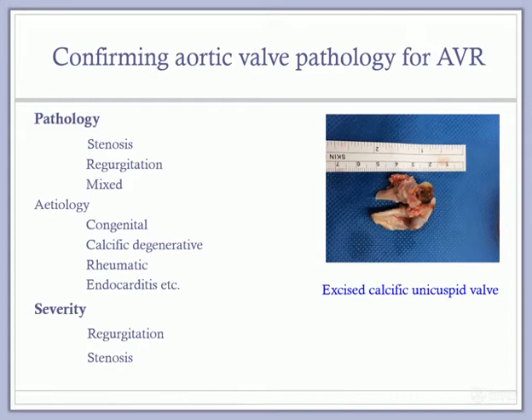The diagnosis is usually correct, and whether it's a bileaflet or a trileaflet valve, which sometimes turns up, isn't really important as the operation is likely to be the same. But sometimes one finds there's unexpected AR, and this will affect the intraoperative management of perfusion.